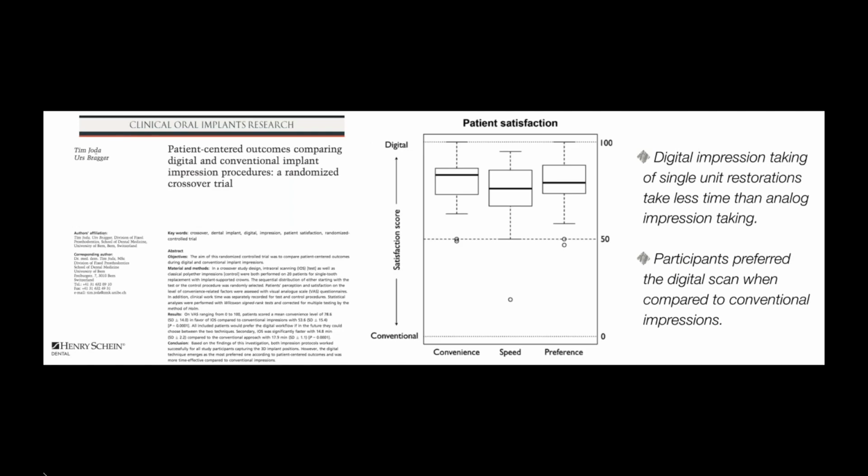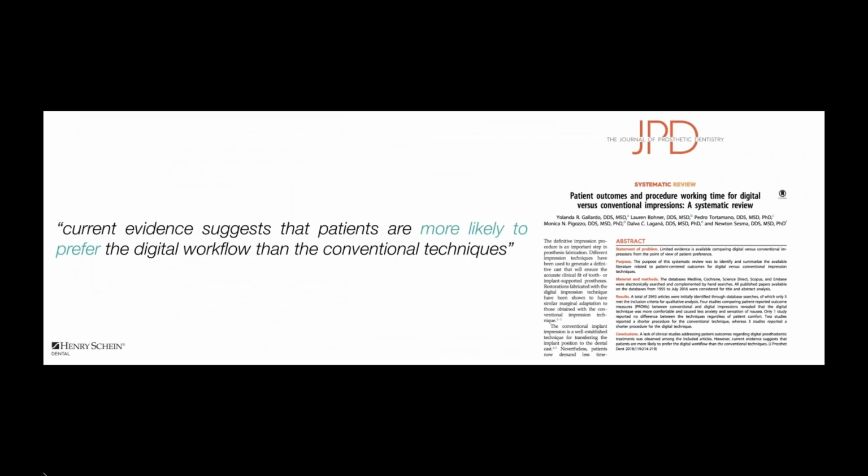And certainly participants prefer digital scanning compared to intraoral material-based impressions, right? We have good data that show patient outcomes prefer absolutely intraoral scanning or optical impressioning.